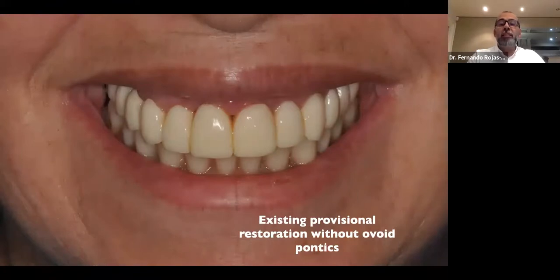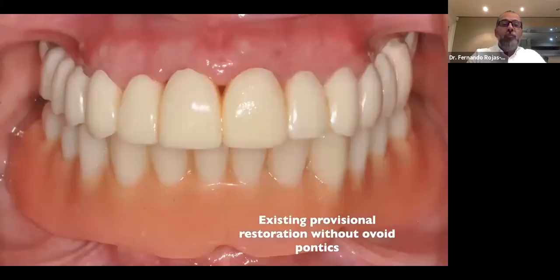Now you need to integrate this prosthesis with the biology of the patient. From the margin of the crown, I need to place my implant 3 millimeters in apical direction, right? And I am planning to place implants in the lateral and last molar. But also the prosthesis is central, lateral, canine to premolar. So below the premolar, you need to have the ovate pontic, also below the two centrals. But you already prepared the ovate pontic for the central. When you prepare in the model, you create 1.5 millimeters.